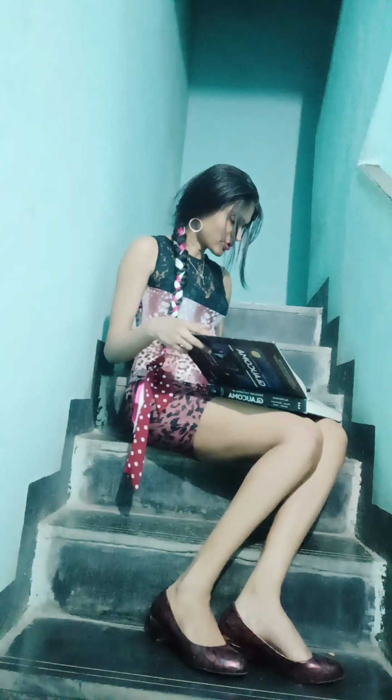Then an assistant is required because the lens needs to be moved, and even the examiner has to move, to visualize the 360 degree anterior chamber angle, to have the entire 360 degree view. So in that case, an assistant is required. Otherwise, if the Barkan illuminator or any light source that can be mounted on the gonioscope is used, the other hand is free and can be used to move the gonio lens to have the entire 360 degree view of the anterior chamber angle. So that was about direct gonioscopy.